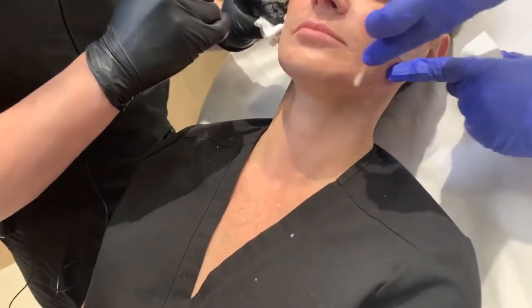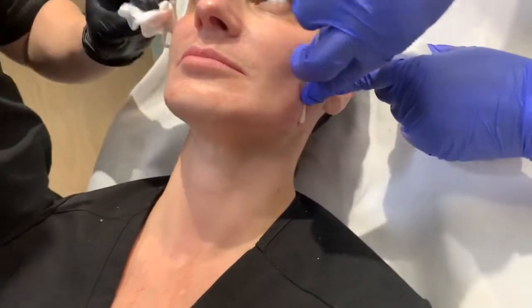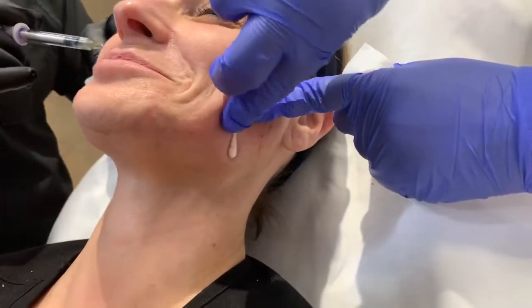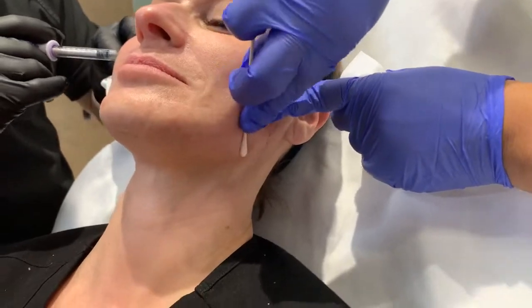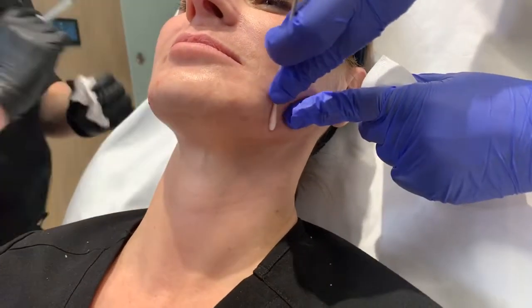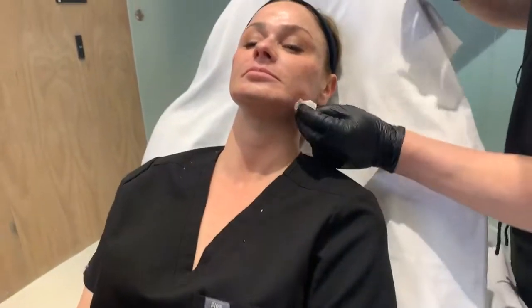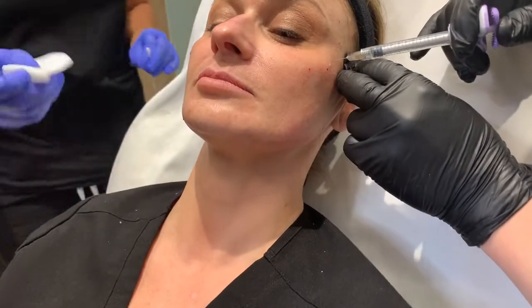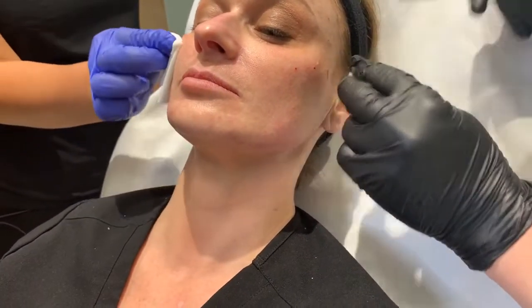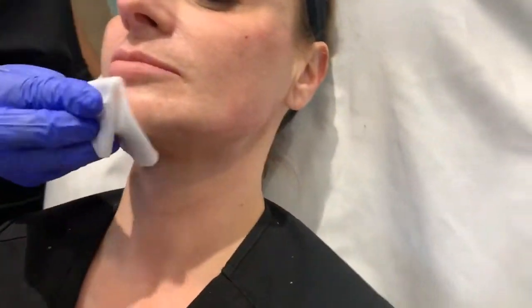What is the Q-tip technique? That's the Q-tip technique that I developed. It's to mold it all into the jaw and make it look super ready to go. All right, we make sure that everything's perfect. Just gonna do a little bit of this lateral hollow because this area tends to, but look at that little, okay, that's not overdone, right? That looks really good, right?